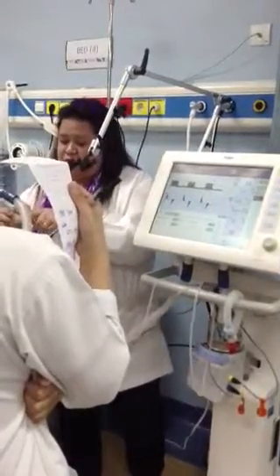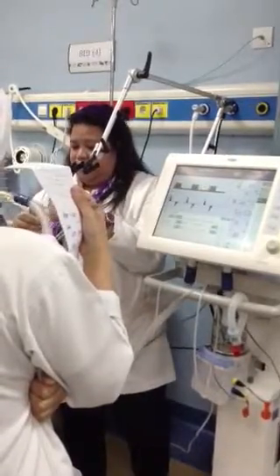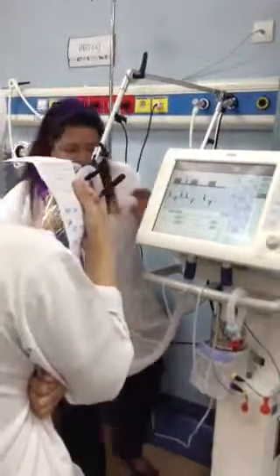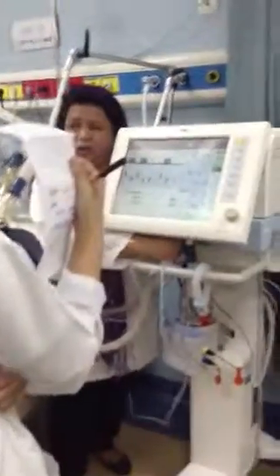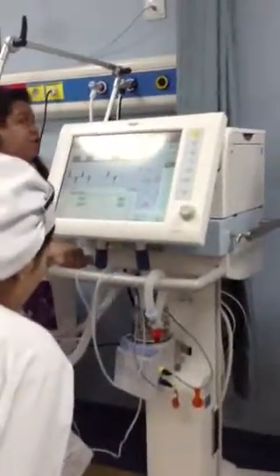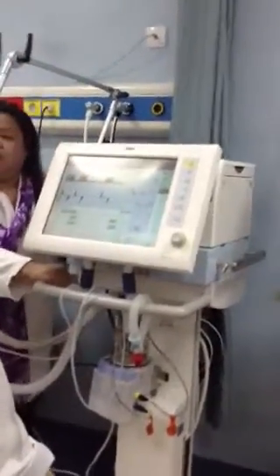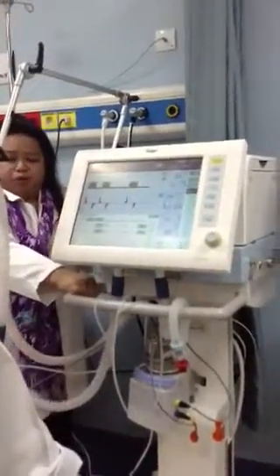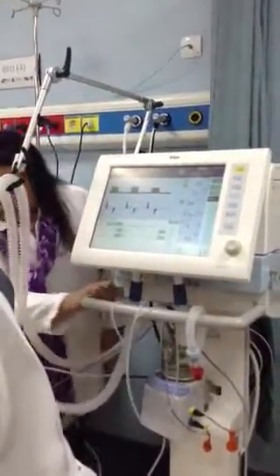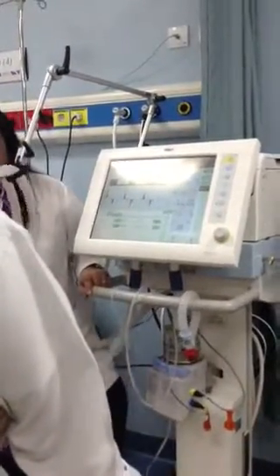So, after nebulization, remove this one, clean, keep it tidy, and put on patient's bedside. I told the ICU staff, you can use this one for nebulization. You have your knob here for nebulization, but I prefer you use your wall outlet for nebulization. You can use your humidifier or your portable tank or your adapter if you have an adapter. I already told how to make the adapter for the ICU nurses.